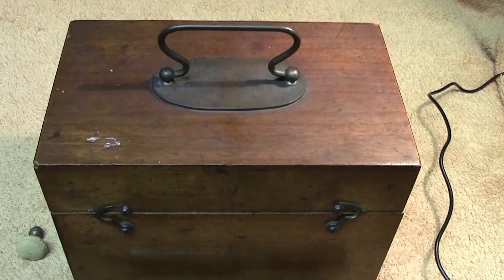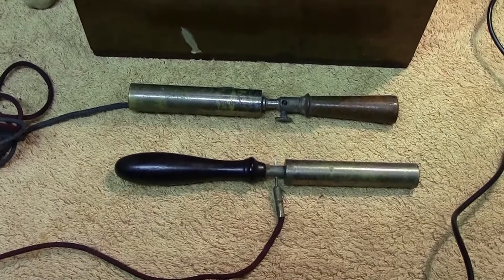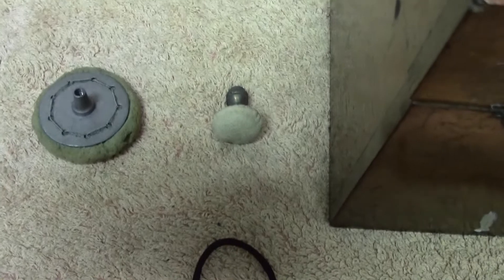Hi everyone. We seem to have a mahogany wooden box — some bits in the front there might give the clue to what we've got in that box. Couple of other things there — let's open it up.